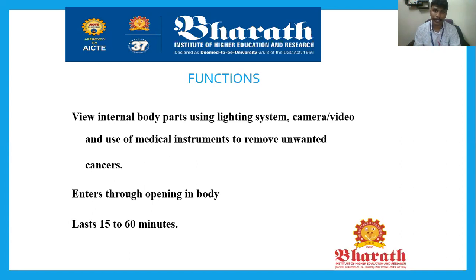This is widely used because, first, it reduces the risk of surgery for the patients. Second, the healing time period is less when compared with surgery. And third, no cut or coagulation, so no blood loss can occur when the procedure is done by endoscopy.